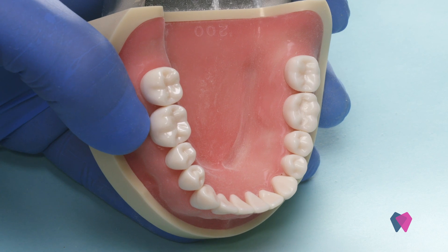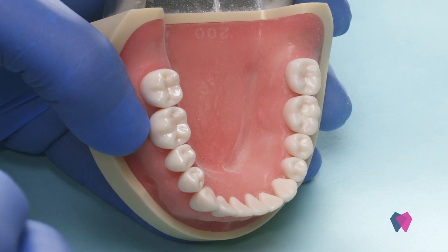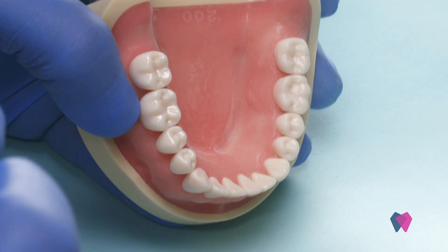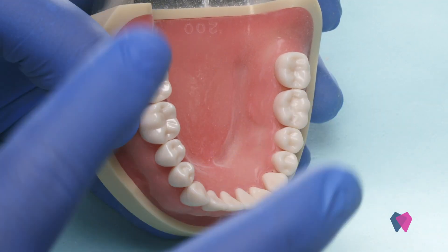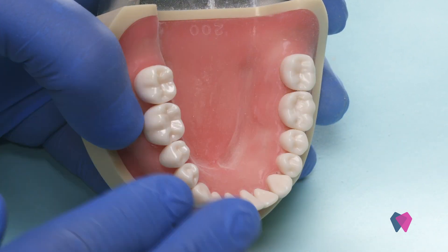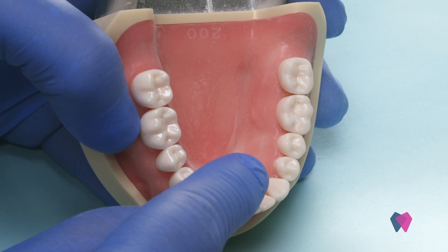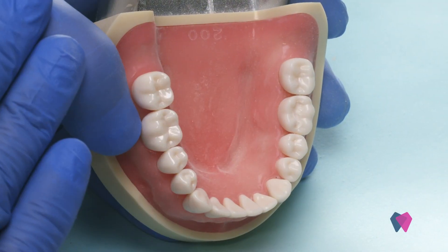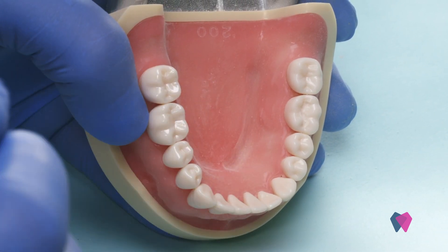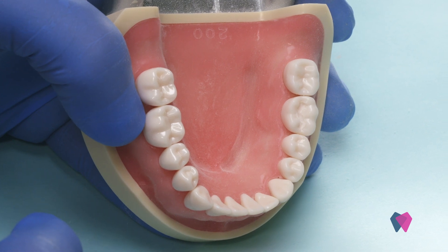These restorations can be very shallow, but if they're deeper restorations and you're close to the pulp, I always line my restorations with a glass ionomer — a flowable glass ionomer — to protect the pulpal surface before we etch. So we clean the surface, place our liner of glass ionomer, and then we etch and bond our tooth. That way we find that we have almost no sensitivity in the final restorations.